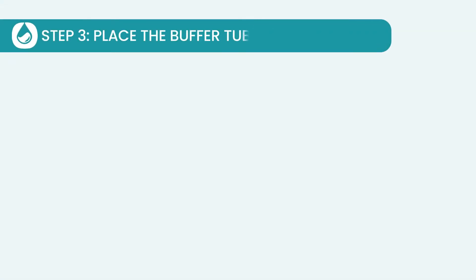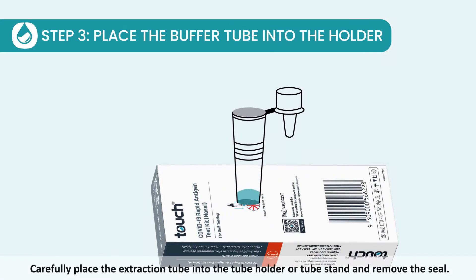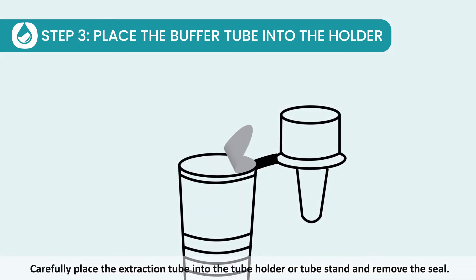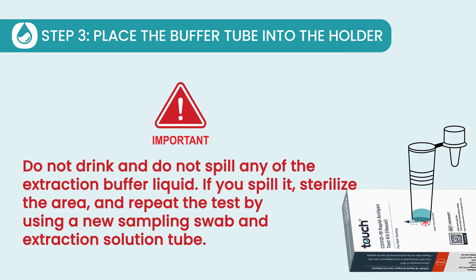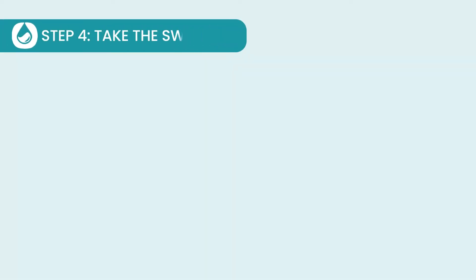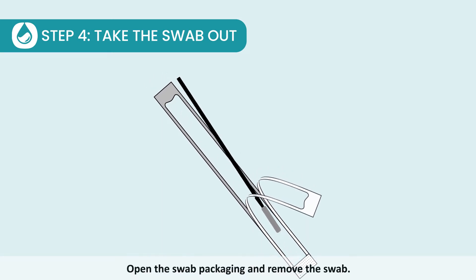Step 3: Place the buffer tube into the holder. Carefully place the extraction tube into the tube holder or tube stand and remove the seal. Step 4: Take the swab out. Open the swab packaging and remove the swab.